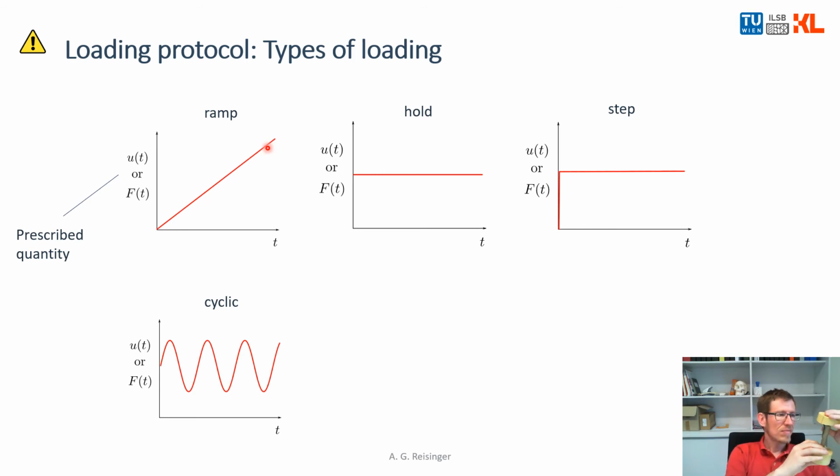But there are other questions that can be answered with mechanical tests. For example, you have a hip implant and you would like to determine how many load cycles or how many walking steps the patient can do until the hip implant is breaking.